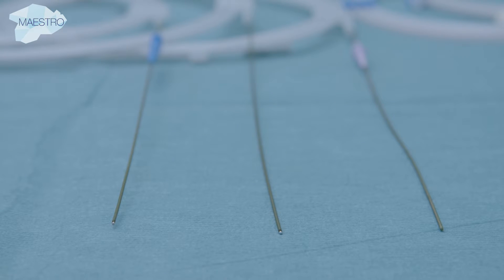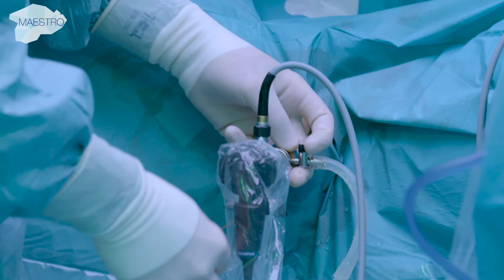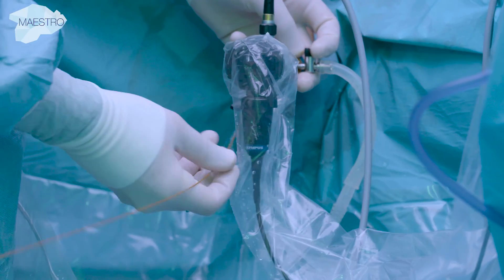Standardized PTFE wires are available in various stiffness configurations, from stiff Amplatz wires to floppy Benson wires, and are selected based on the patient's anatomy.